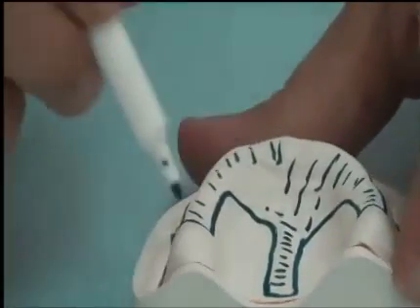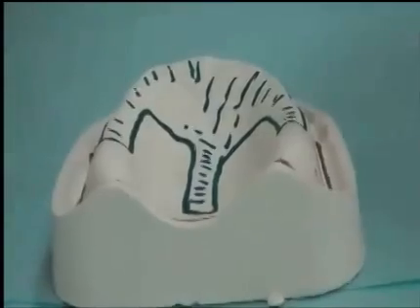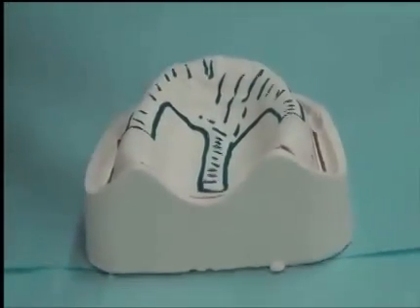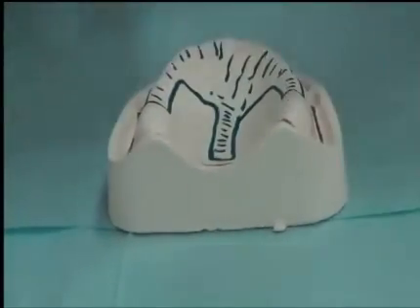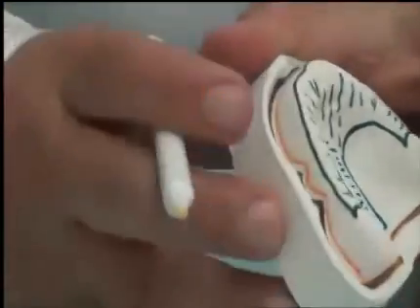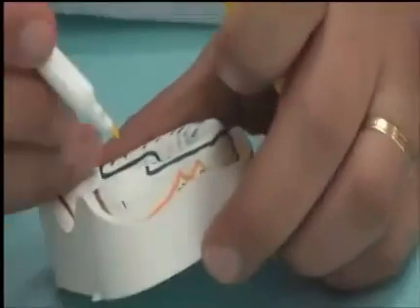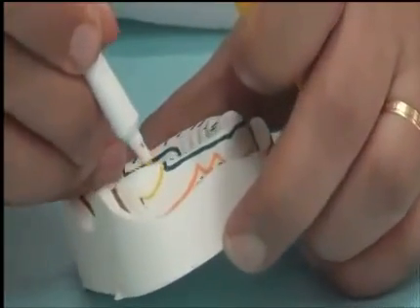Now the areas in white between the border of the wax and the border of the tray are all primary support areas. So these are all primary support areas where the impression will be in a mucocompressed status. Okay? Except for the tuberosities called the secondary support area.